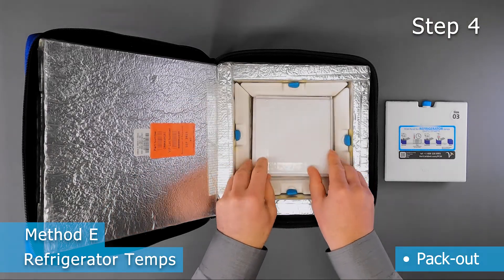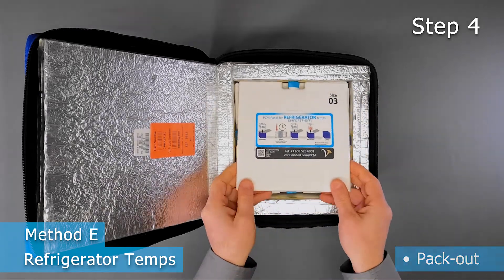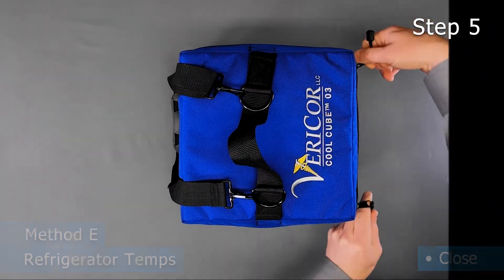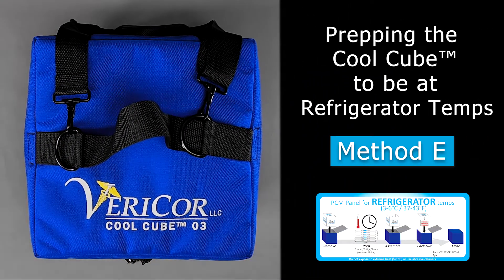Lastly, pack out the product into the CoolCube and place a panel on top to complete the system. Close the case and relax. The product is now in a qualified system that will keep it at a refrigerator temperature for a very long time.